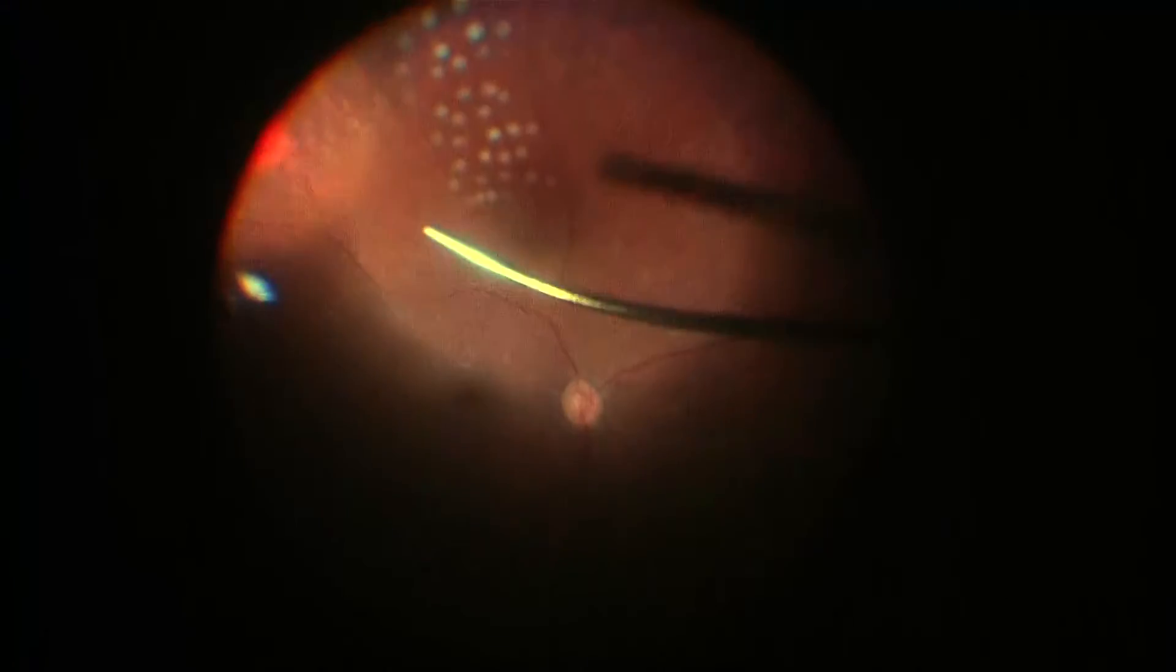There's two disease-modifying therapies that we're really applying for this surgery. Number one, we're removing the vitreous, and that's what retains the vitreous hemorrhage, what retains the VEGF and provides a scaffold for surface proliferation of fibrosis. Now that we've removed that, we're going to turn to panretinal photocoagulation. That's the second thing. That ablates the peripheral retina, decreases the peripheral ischemia that's going to drive secretion of VEGF and all the proliferation that comes with it. You can do this in the clinic using a laser indirect or a slit lamp-mounted laser. However, with a patient's vitreous hemorrhage, you weren't able to perform that for this particular patient. That's why we're doing this in the operating room.